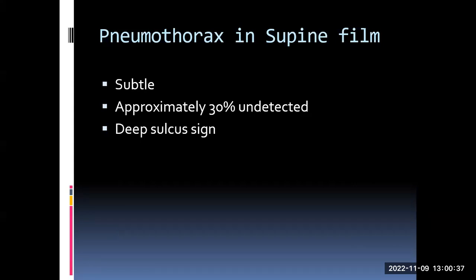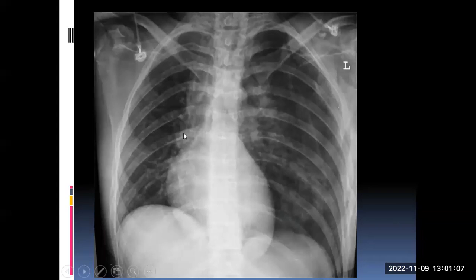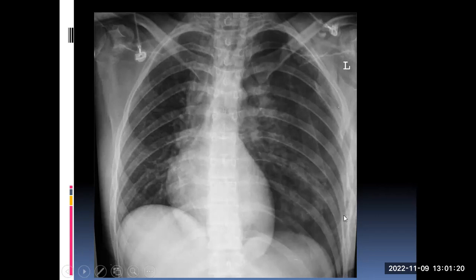That was a PA erect film. Pneumothorax in a supine film is much more subtle — approximately 30% can be missed. This is very important because we need to exclude pneumothorax in trauma patients who are mostly supine. We have the deep sulcus sign for supine films: you can appreciate that one costophrenic angle is very deep compared to the other side, going way beyond it. This is the positive deep sulcus sign. If you look carefully, you can also see the lung edge. Also there is a pitfall with skin folds that can give a false impression of a lung edge; to differentiate, look for lung markings beyond the apparent line, or trace the line to see if it goes beyond the confines of the lung.